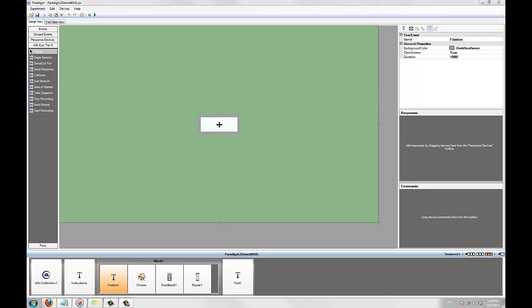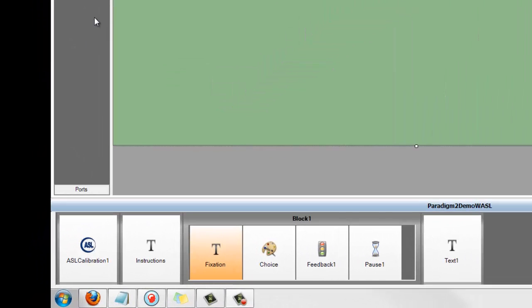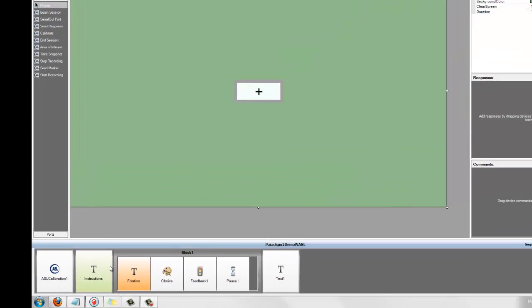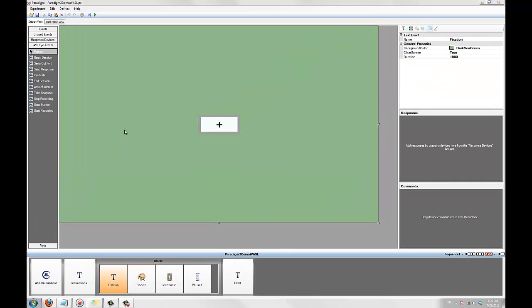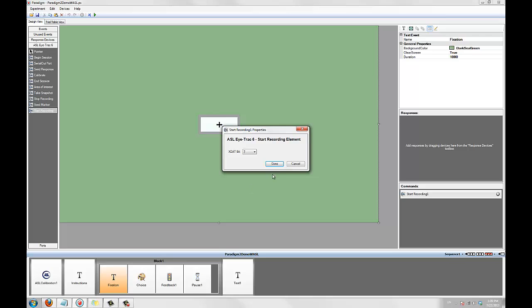To start and stop IData recording, use the start recording and stop recording elements. We're going to add a start recording element to the fixation event to start recording data at the beginning of each trial. So we'll drag the start recording element into the fixation event's commands area. The default settings are typically correct.